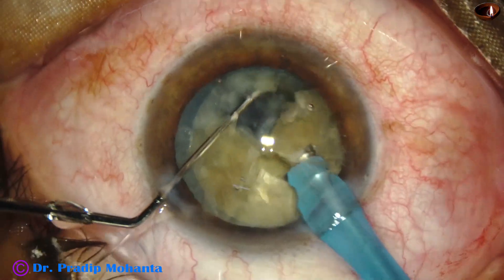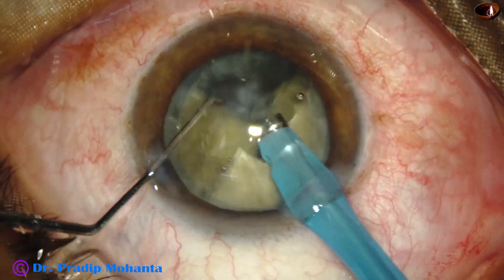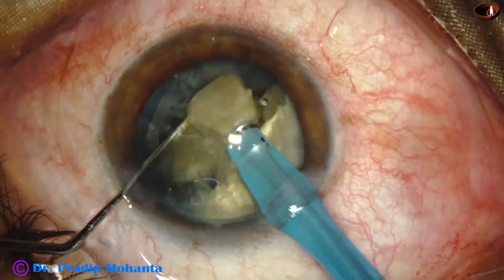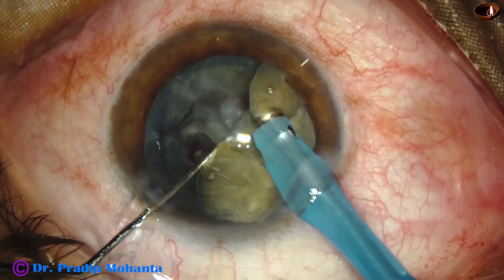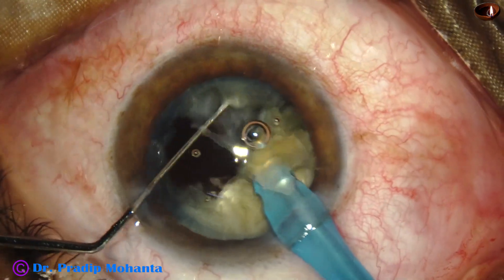And now each large fragment is pulled to the center of the anterior chamber at the iris plane and it is emulsified. Each large fragment is subdivided into smaller pieces by the chopper.